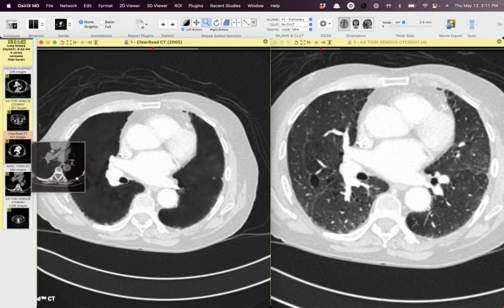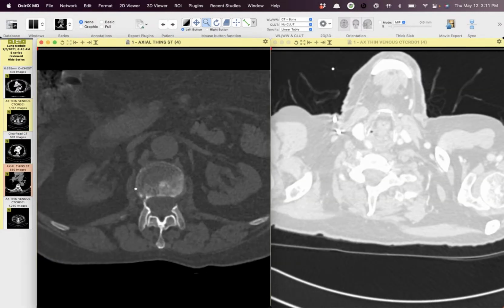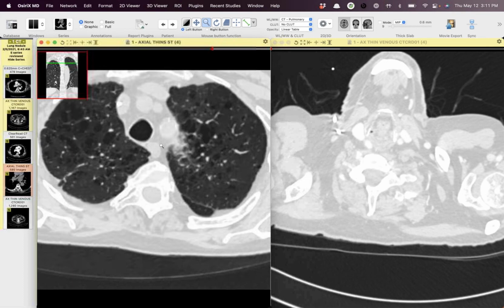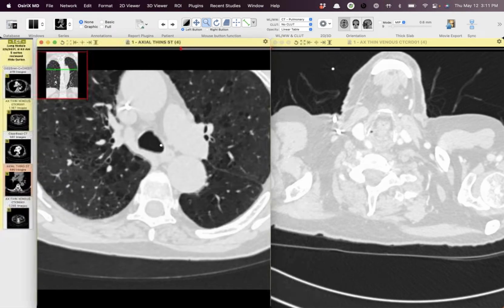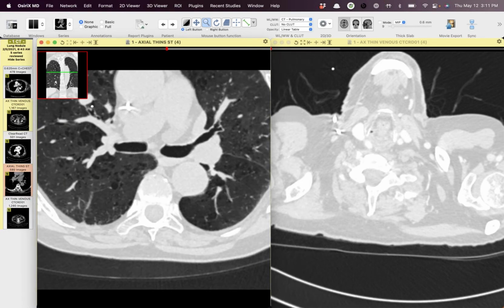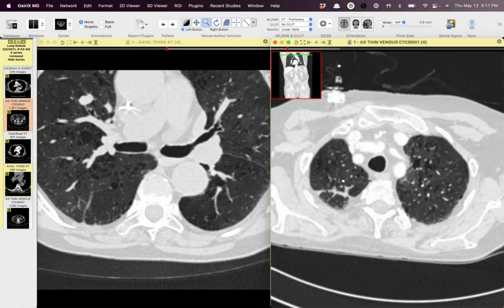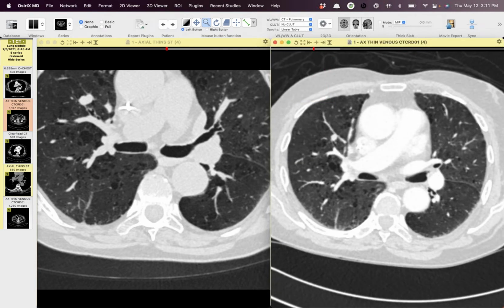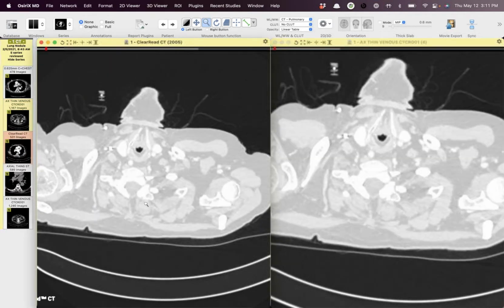I think this is just a classic incidental nodule case and kind of a Swiss cheese model, because a couple months later they get a thoracic spine CT, and it's definitely getting bigger there, and then it was eventually picked up on a follow-up study when it was a larger lung cancer. But do you use anything like this?